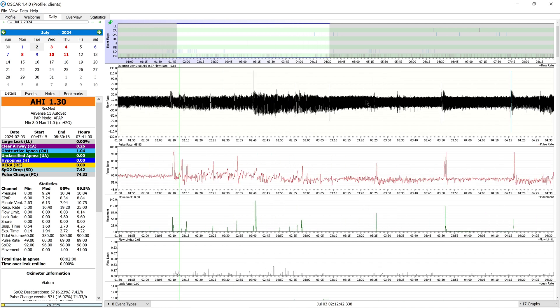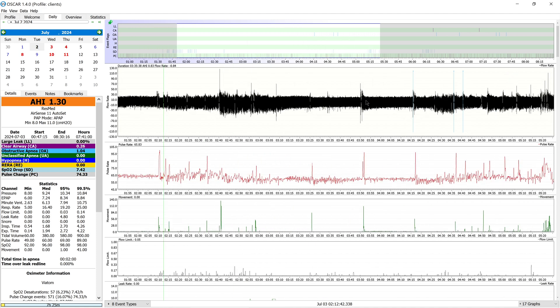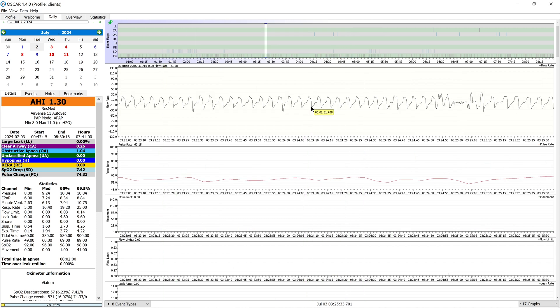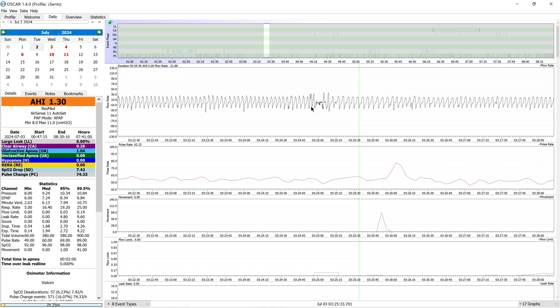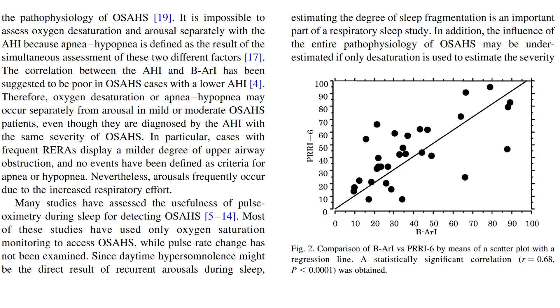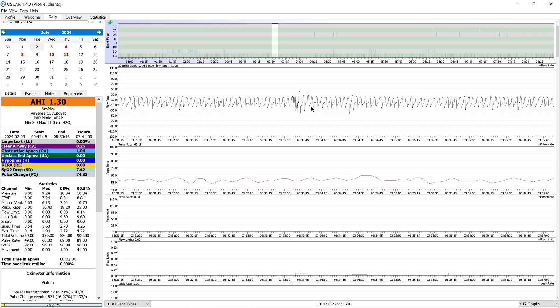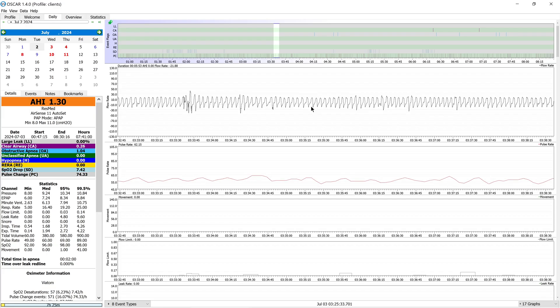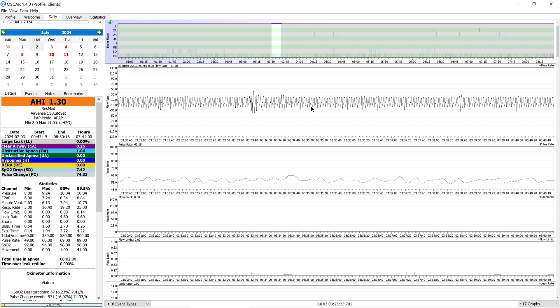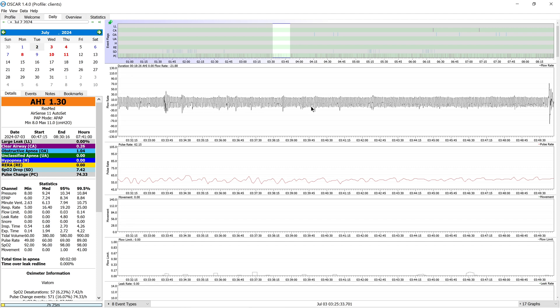The higher these pulse spikes are, the stronger we can be with our assumptions. The smaller ones actually have a little bit more statistical error to them. You might ask what does the literature say — basically the literature demonstrates that there's a very strong correlate, but it's not perfect. In other words, there can be false positives: pulse spikes that are not actually coinciding with sleep-disordered breathing as a physiological response to a breathing event.